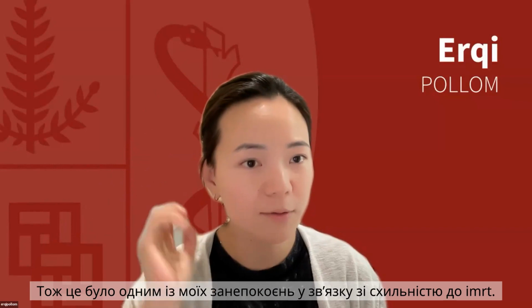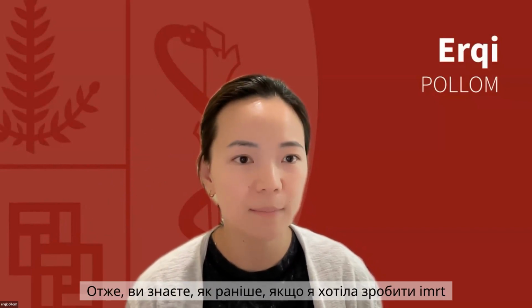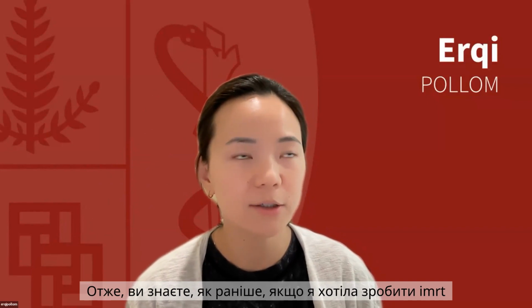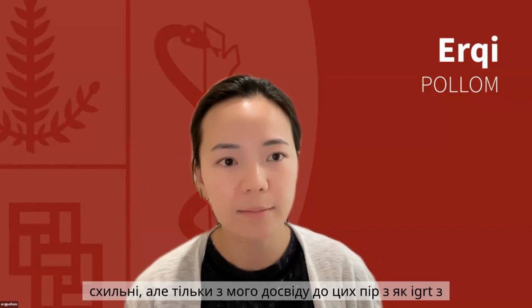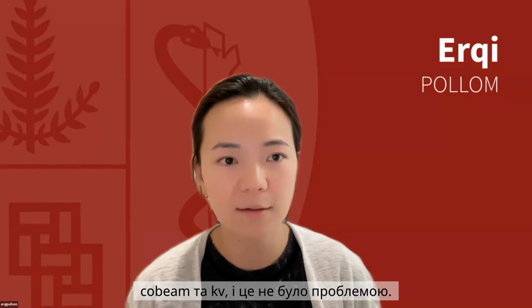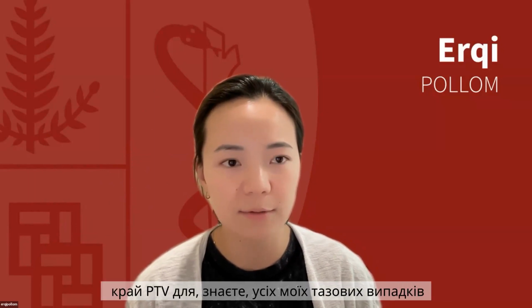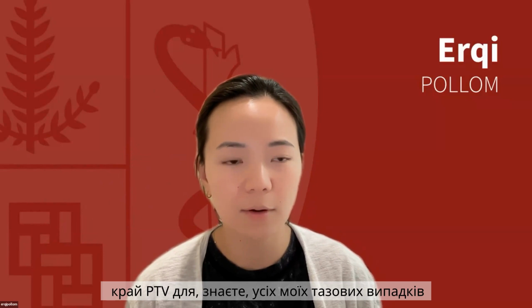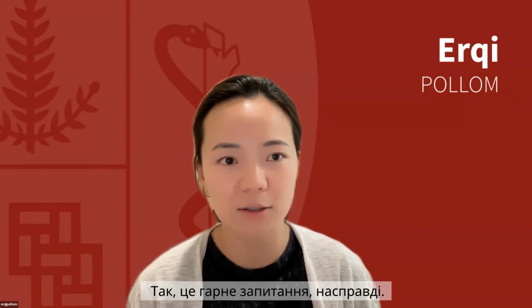Yeah, perfect. That was one of my concerns with doing IMRT prone. Previously, if I wanted to do IMRT for whatever reason, I would always send them supine because I was concerned about the setup with prone. But in my experience so far with IGRT with cone beams and the kV, it hasn't been an issue. So my margin is actually the same. I use a 5 millimeter PTV margin for all of my pelvic cases. But I haven't run into issues where the setup with prone has been challenging.